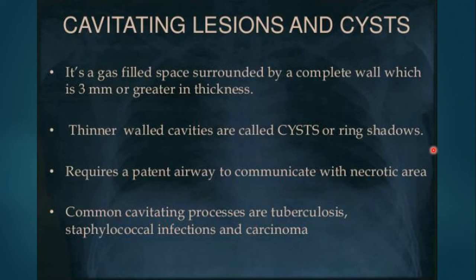Since they contain air, there must be an airway that is communicating with the cavity, with the necrotic area, giving air to them, unless it is by a gas-forming bacteria. That's a different story. Most of the times it is the gas present in the lesion due to an airway that is patent, connected to the cavitating region. What is the commonest differential diagnosis of a cavitating lesion? Tuberculosis, staphylococcal infection, and carcinoma. Three differential diagnoses.